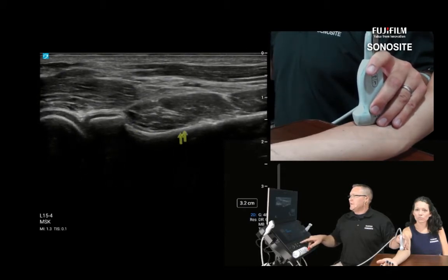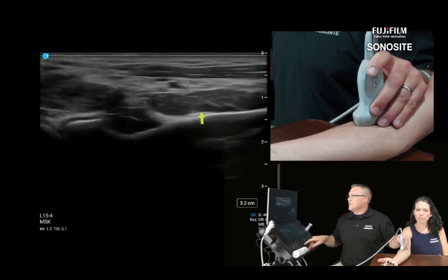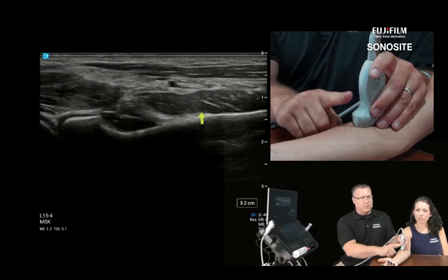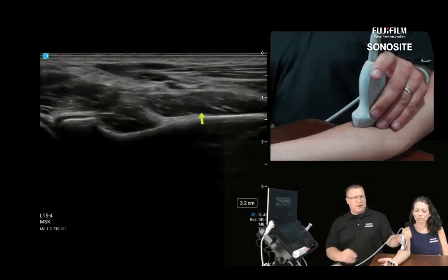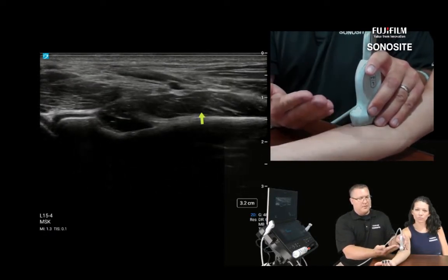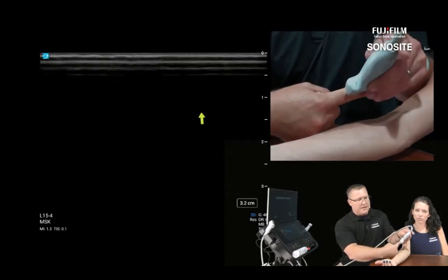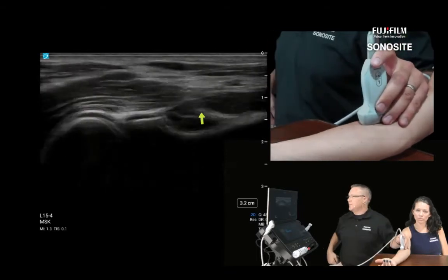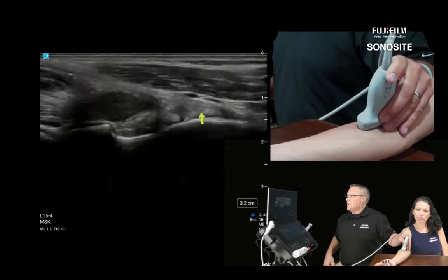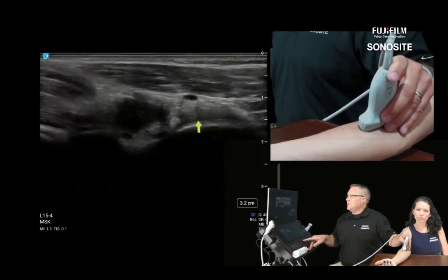It's after the neck. So after the neck, I'm looking for the distal biceps tendon here, and I know that it's pointing more medially, towards the ulna almost. With hypersupination, I'm going to traverse this way medially and aim laterally. Because we're scanning a cylinder, I have to aim back into the cylinder to hit that distal biceps tendon properly. So what I'm going to do now is go medially and aim the beam back into the cylinder. And there we have that radial head, neck, and tuberosity showing itself really nicely.